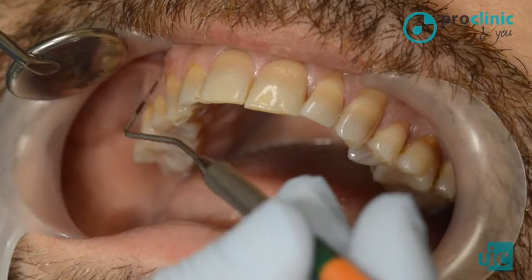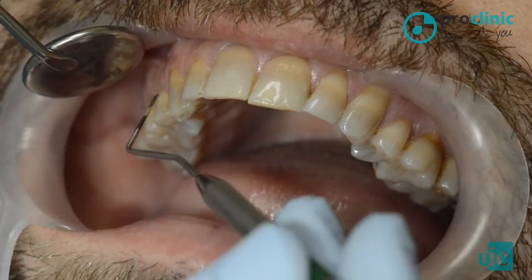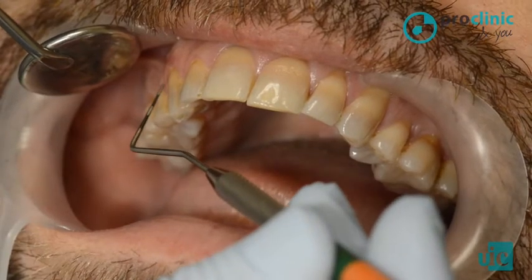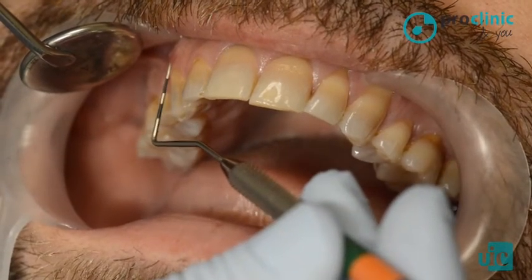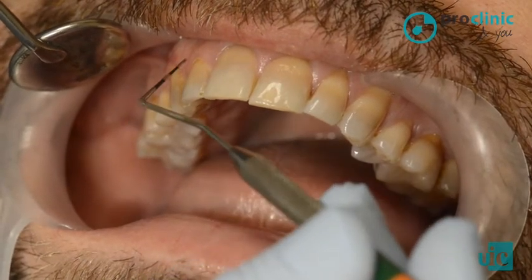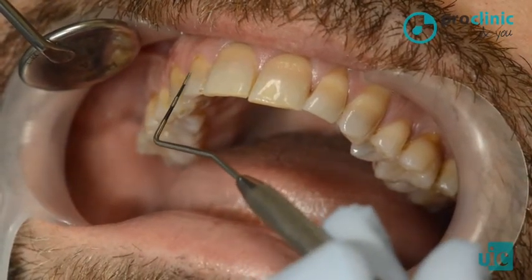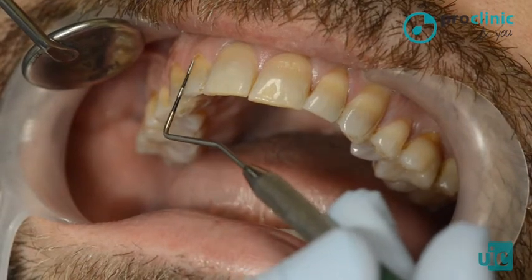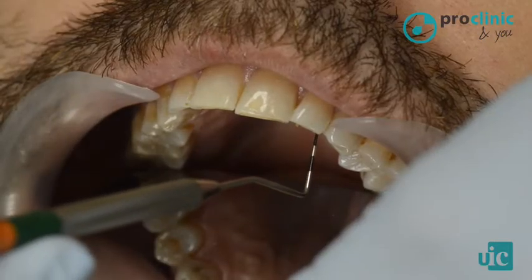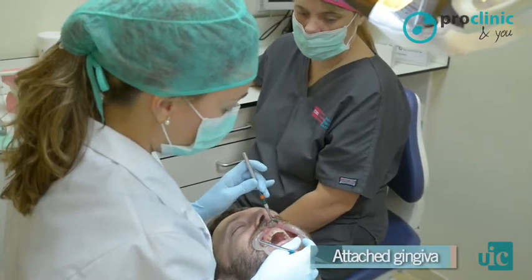If the gingival margin is at the cemento-enamel junction, we have a 0 value. When the gingival margin is apical to cemento-enamel junction, we have a real gum recession, and it is recorded as a positive value. And when the gingival margin is coronal to cemento-enamel junction, we have to record it as a negative value. 0, 0, 0.